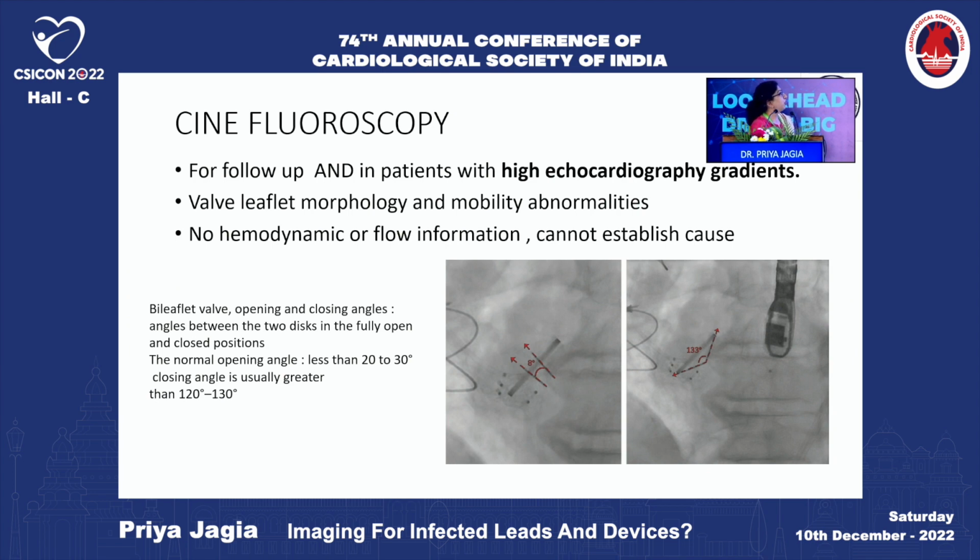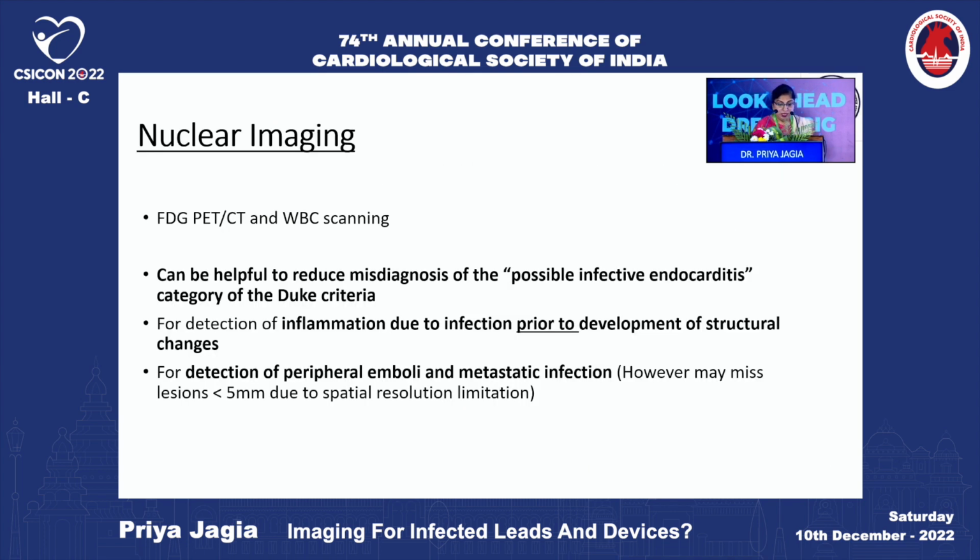Beyond echo, you can do a cinefluoroscopy, which is very good for follow-up and in patients in whom you find high echocardiography gradients. What we see on the valve is the valve movement. We look at the opening angle, which is usually less than 20 to 30.